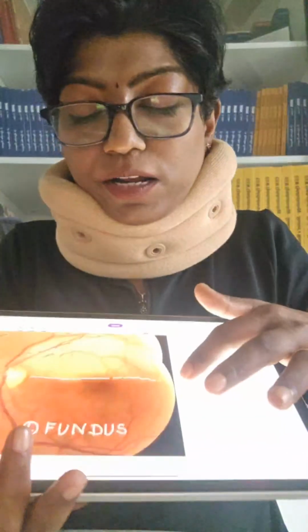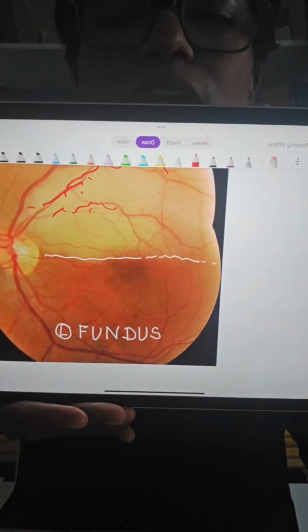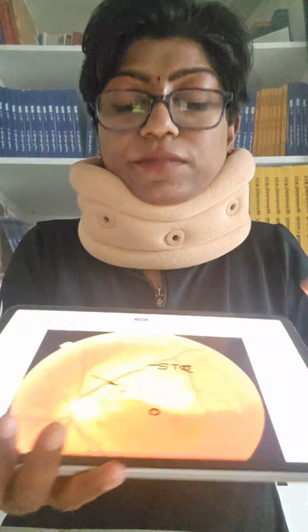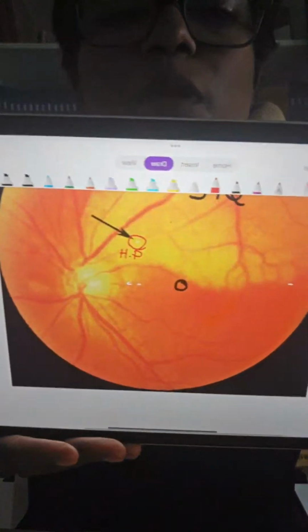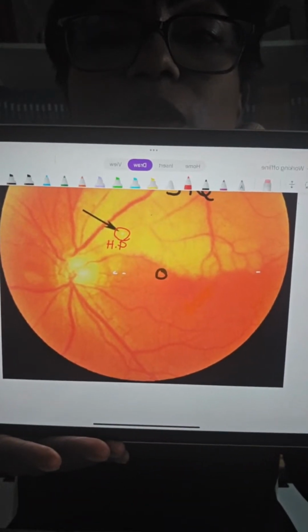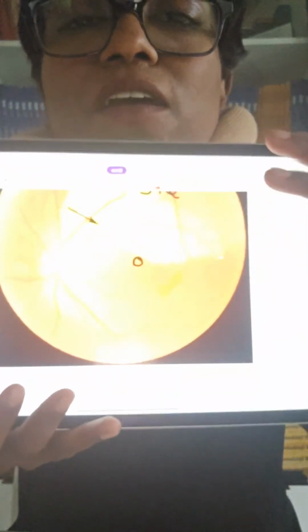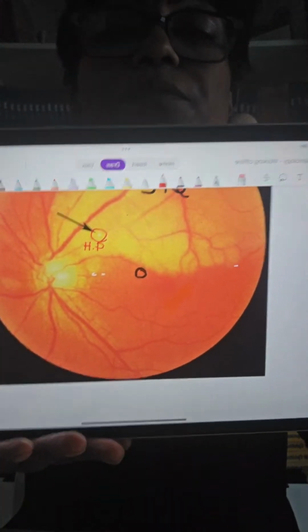So, do you see that? Very good. See here, the foveola itself is not involved. So, that is why it's neither involved nor spared. So, no cherry red spot. If it is involved, then maybe you'll get cherry red spot. Okay, so here again, see, the foveola is not involved, so we don't have a cherry red spot. Understood? Clear? If that opacity would have extended to involve the foveola, then probably where I marked that black circle, we would have had a cherry red spot. Is that clear? So management is essentially the same, just like how we discussed in central retinal artery occlusion.